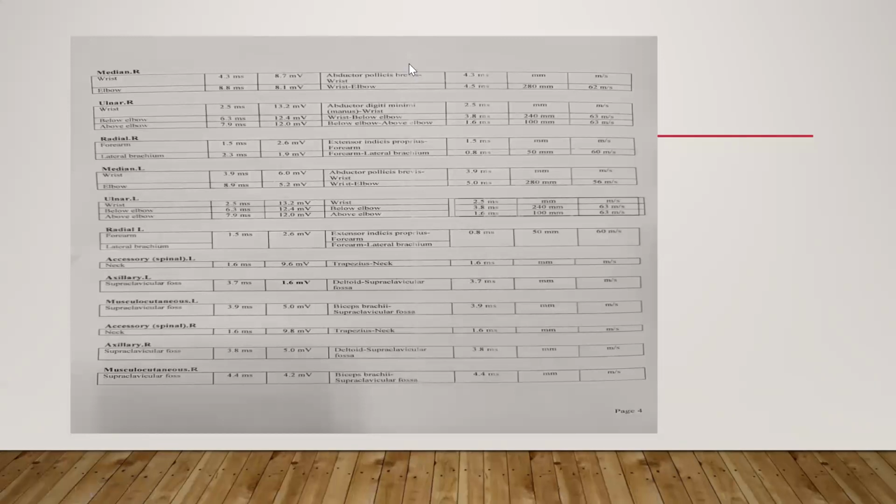Yes, because why not upper trunk? Ma'am, in upper trunk, biceps will also be involved. Very good. So musculocutaneous would be abnormal, no? Yes, if you do the upper trunk, the biceps will be affected. Biceps CMAP is checked by musculocutaneous, so musculocutaneous would be impaired. Okay. Yes, ma'am.